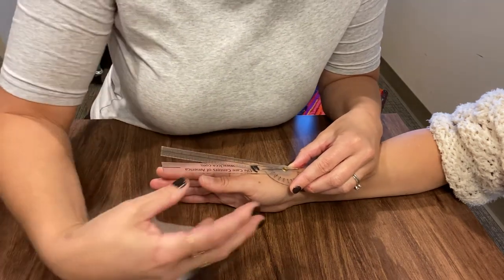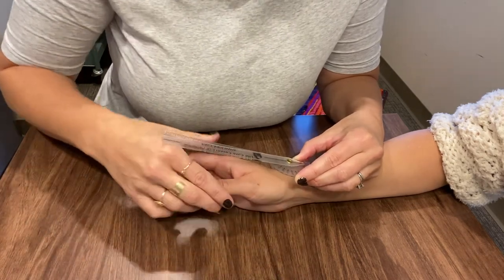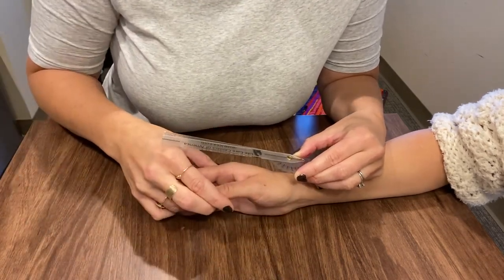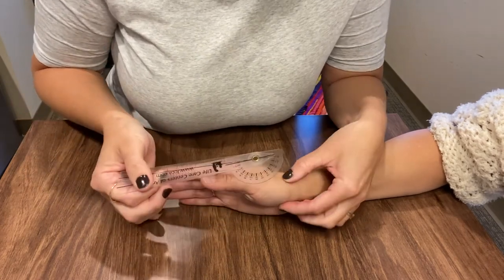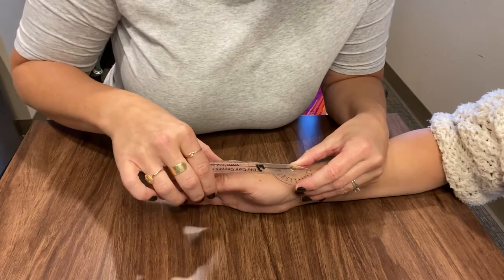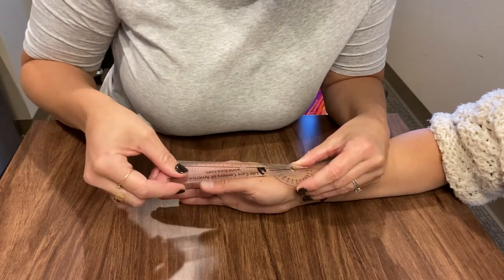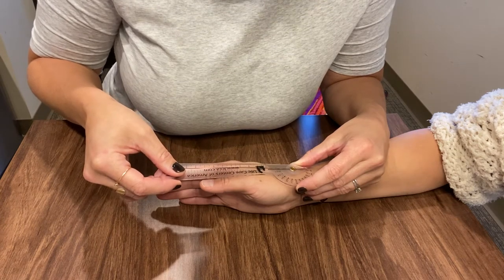For instance, my dad has a lot of chunky muscle around here, so his neutral is like here. You're going to have to do some math, but bring them to their baseline. So I'm going to bring her all the way to her palm and she's at about five to ten degrees right here.